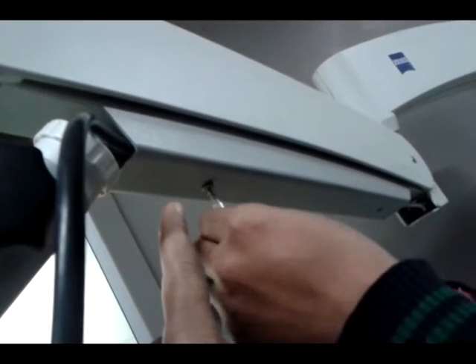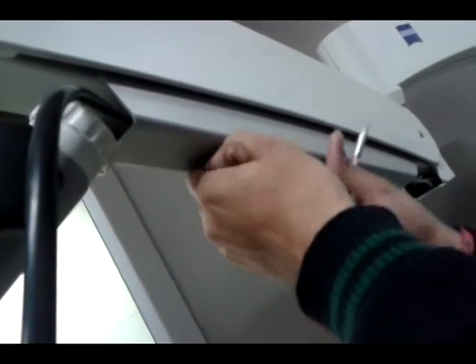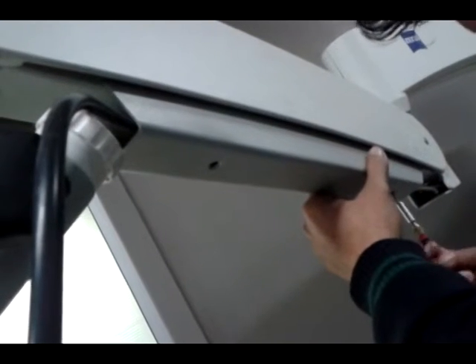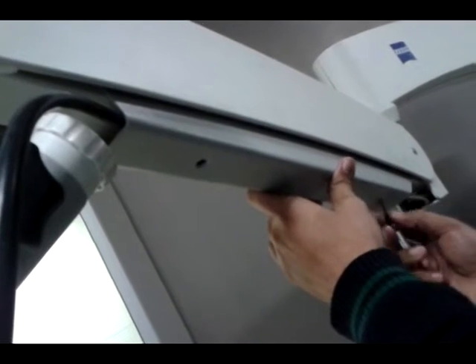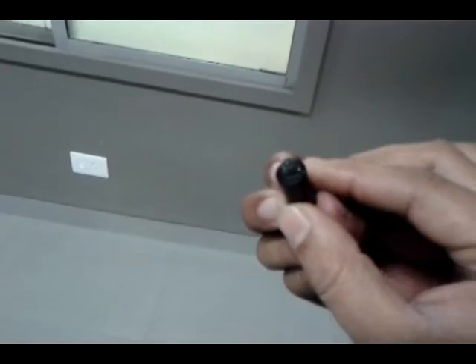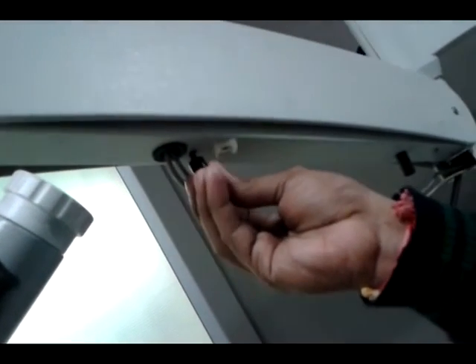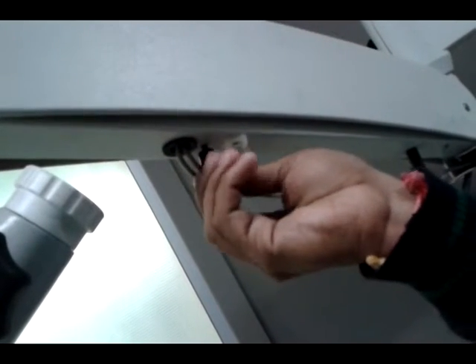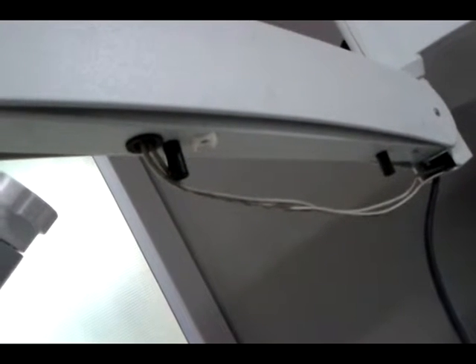Now we have to unsecure these screws to open this cover. This is the stud which we have to put below, in the space given, like this. Now we will take the cover.